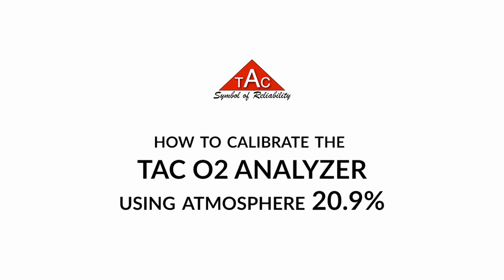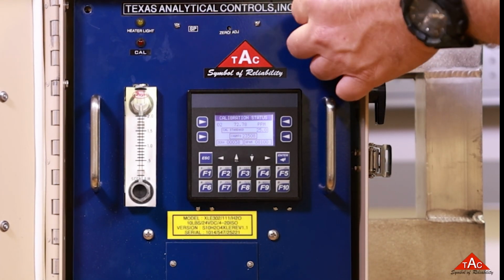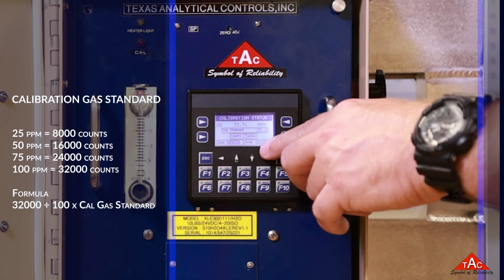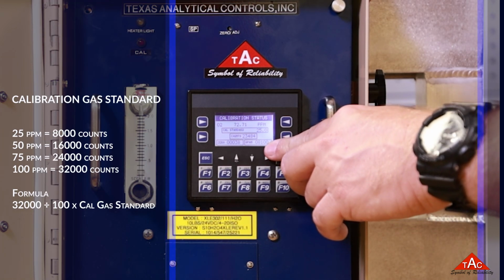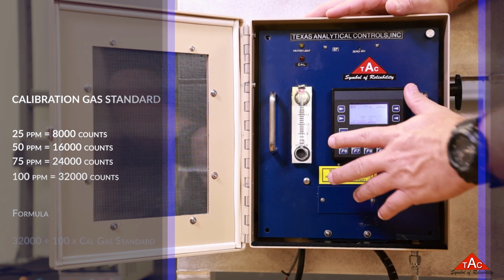How to calibrate the TAC O2 Analyzer using atmosphere 20.9%. First, press F2 to check the calibration status screen. Compare the numbers against the calibration gas standard, as shown here. If all numbers are correct, press F1 to return to the home screen.